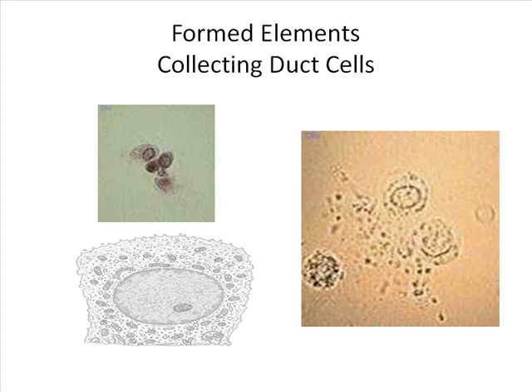Some of these you can see, notice how large the nucleus is, and these are the ones that have the flat edge. I said it was a transitional. It's not transitional. It's the collecting duct. Let me see if I have another example. No, and I don't have any good examples in an actual microscopic where it shows the flat side.